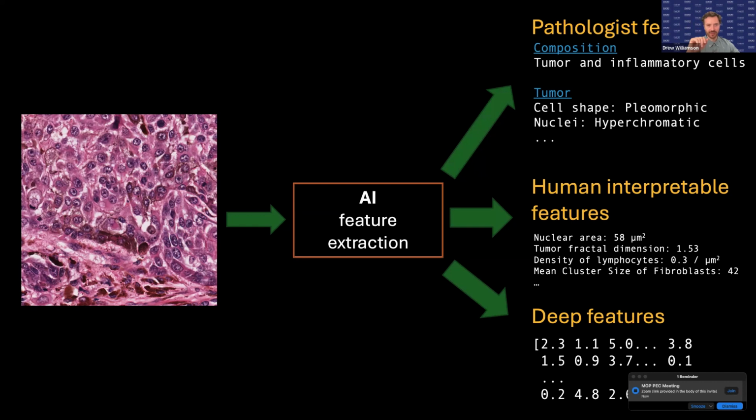For example, the pattern of the type of stroma. We have this desmoplastic stroma, which is usually more pink or maybe more gray because of the collagen deposition. There's more collagen in the area around the tumor cells sometimes than there is otherwise. And it's difficult for me to see, at least right away, what human interpretable feature would capture that.